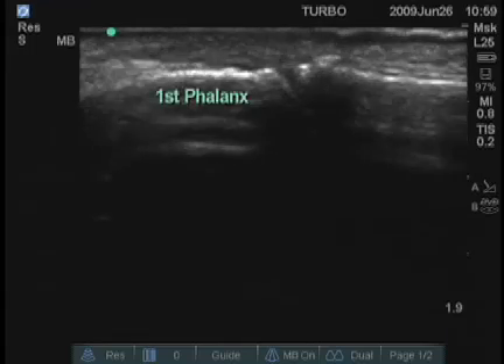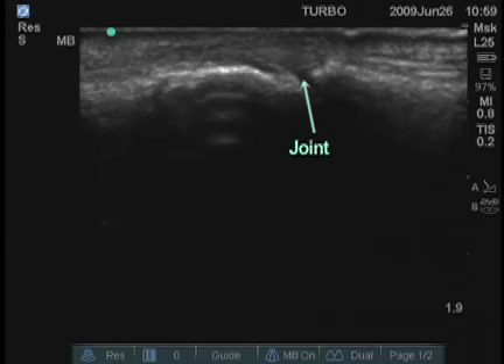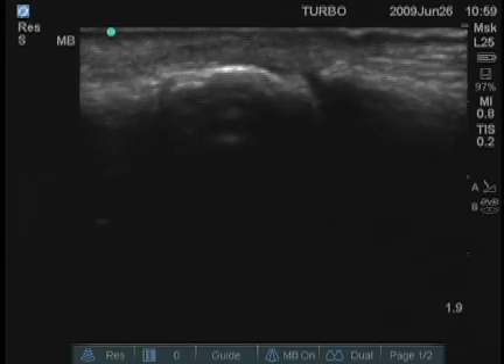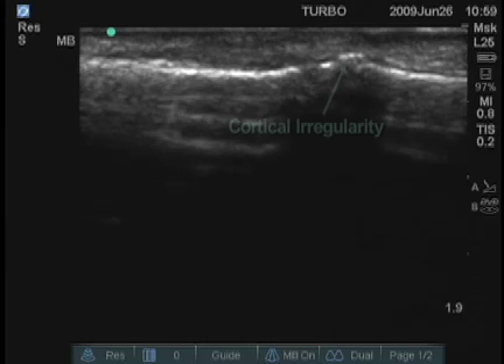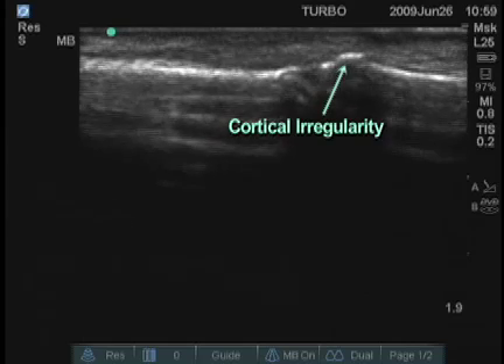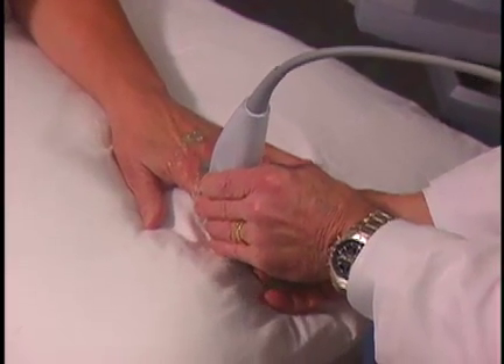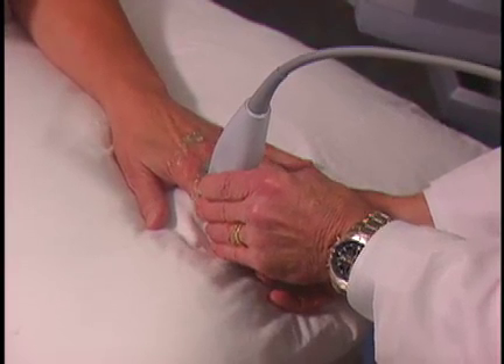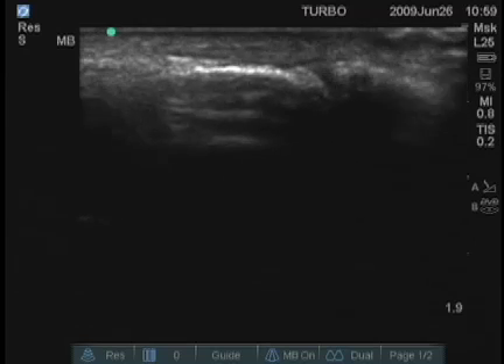We'll look at the PIP. This is the distal end of the first phalanx, and the joint is this space here. She happens to have a small amount of osteoarthritis here with some irregularity of this cortical surface. I can slip my finger in here and show you where this is actually moving — you can see that joint flexing and extending.